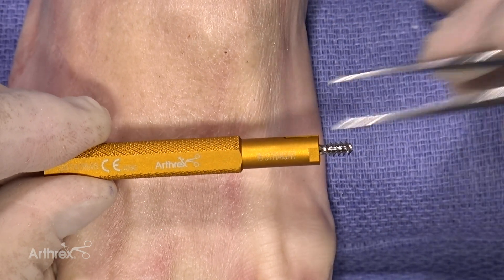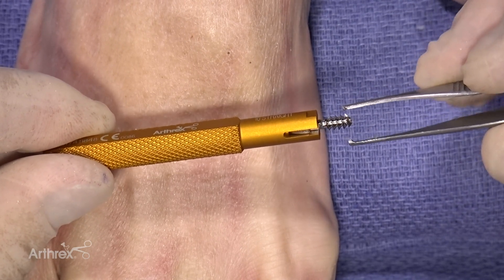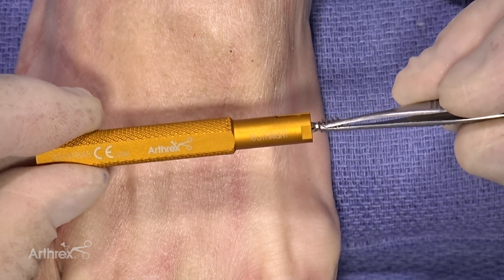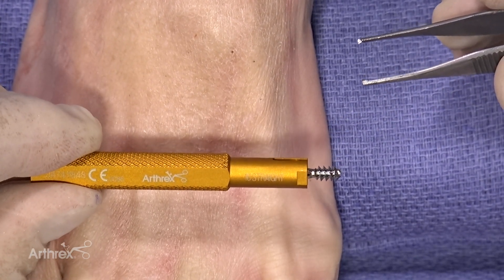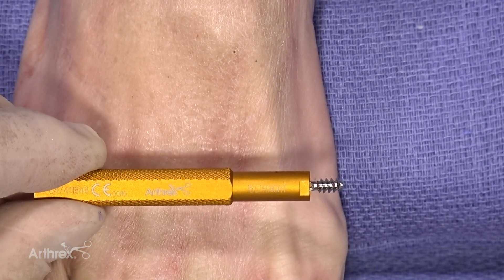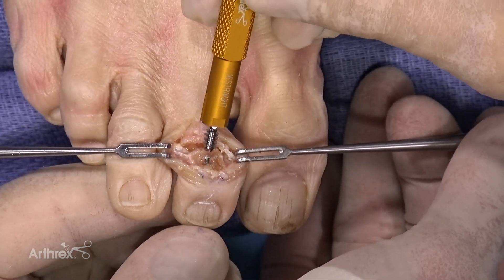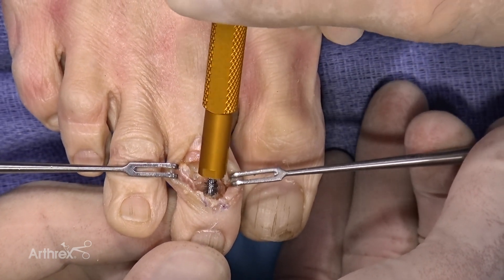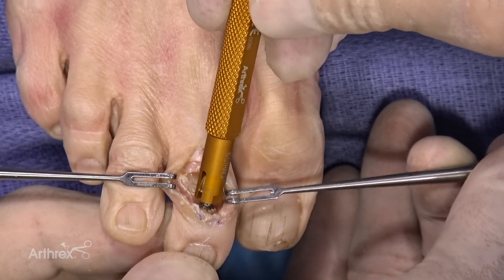Now let's look at our device — this holds the hammer toe implant with the screw portion in place, and it's cannulated. The color is immaterial; each size has its own color. But look from the side to determine whether it's straight or bent. This one is a straight implant, and there's a key showing a flat surface on each side — that's important because when you're done implanting it you want to see that flat surface. With the K-wire left proud, I bring in the implant, twist the screw portion into the middle phalanx drill hole, and it seats very nicely.